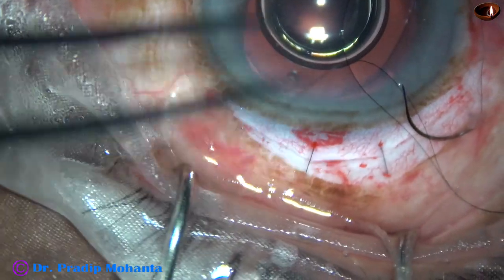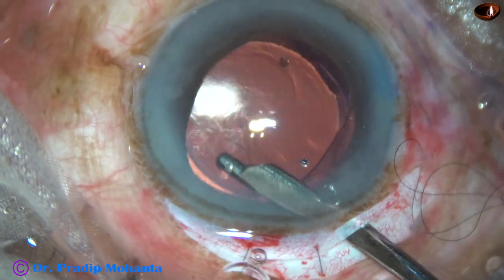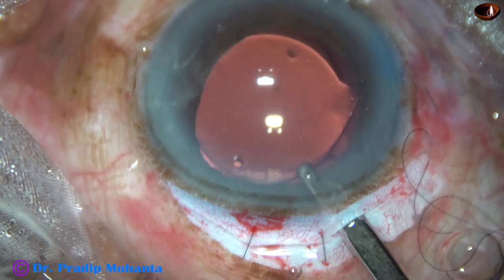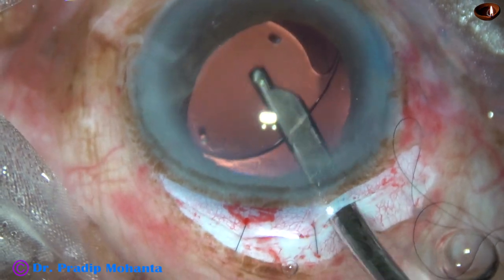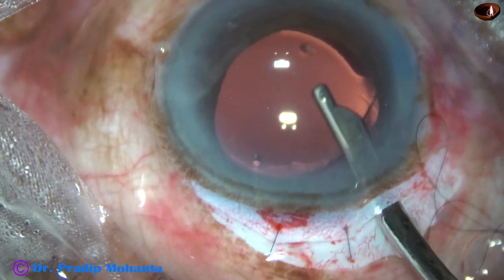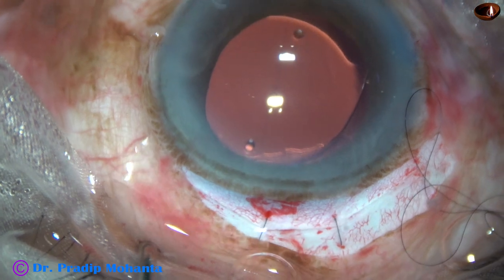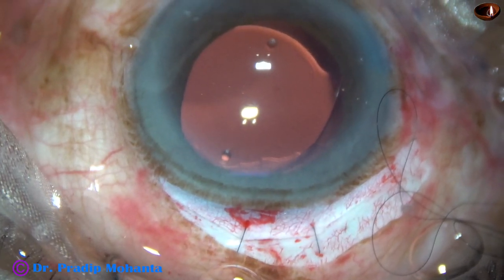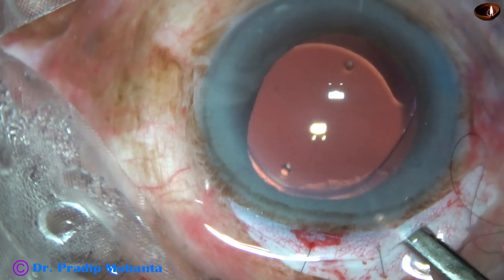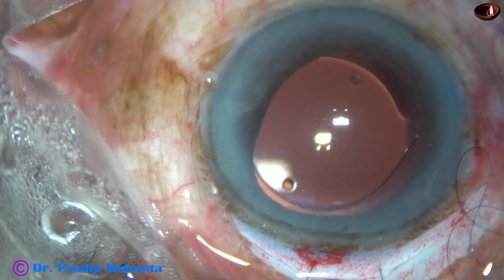And now we have a lot of visco in the anterior chamber — we must remove that. So here I am going to remove all the visco nicely. I spent a lot of time removing the visco in this part of the surgery; the video has been edited a bit and I am not going to show removal of all the visco. Spend enough time so that you become sure that all the viscoelastic substance has come out. I find that the wound is nicely sealed, the tension is adequate. The side port didn't need any hydration in this case.